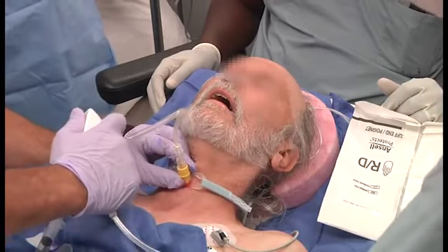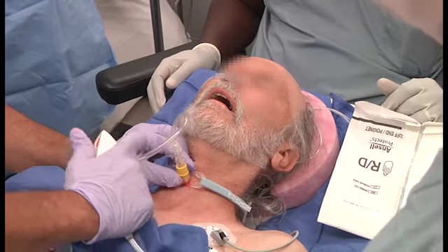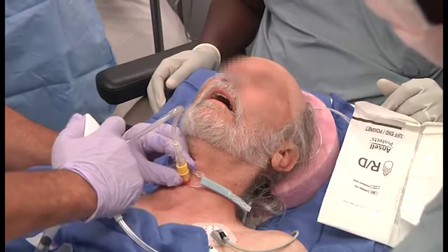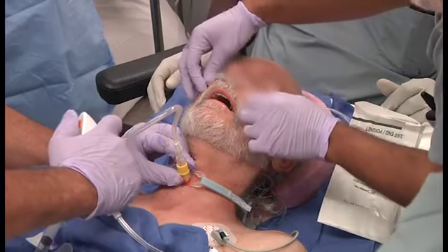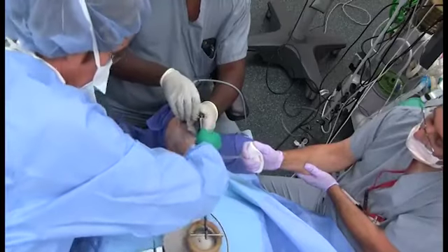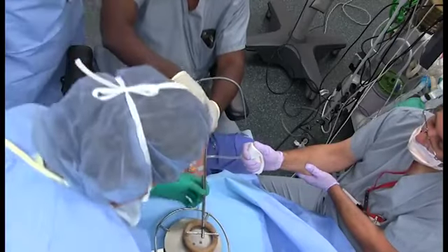For the remainder of the surgical procedure, anesthesia was maintained using total intravenous anesthesia, including an intermediate duration neuromuscular blocking agent. Suspension laryngoscopy was placed.